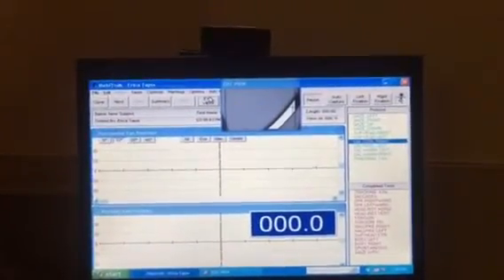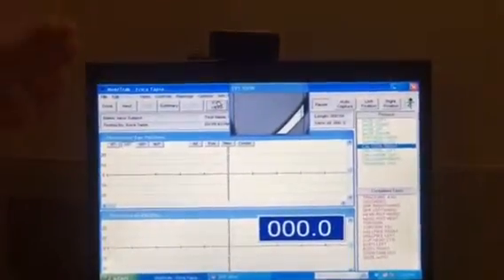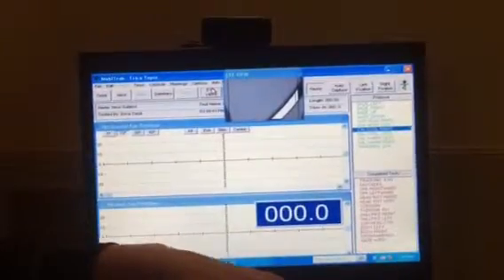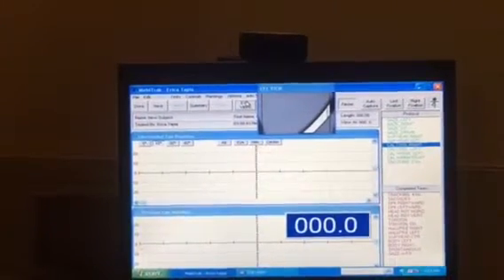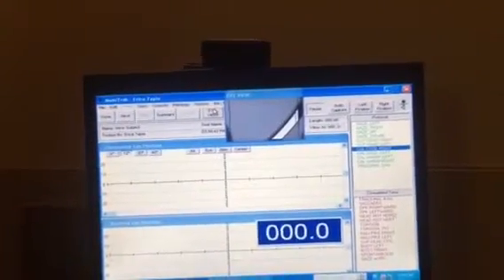So you're going to be blowing the air for 90 seconds. You already have your preset temperatures, the cool air, and then once you're finished with blowing the air, you're going to start your test. Tell your patient to put the head forward because if they keep it in this position, you're not going to get nystagmus. So you're going to look forward, head straight, open eyes.